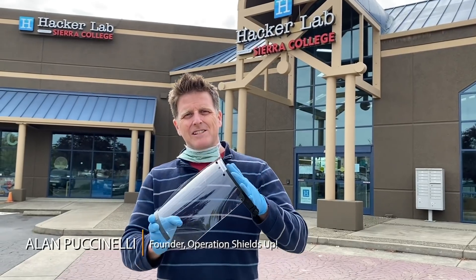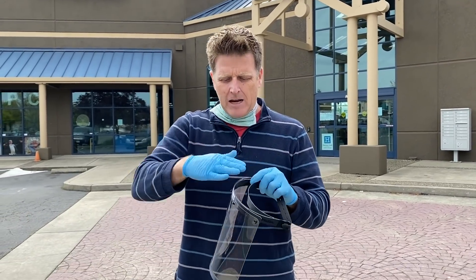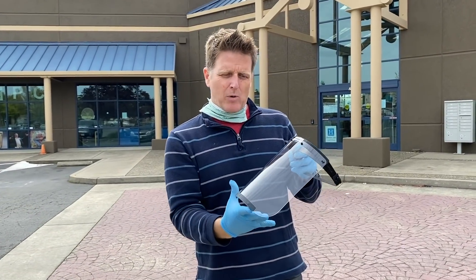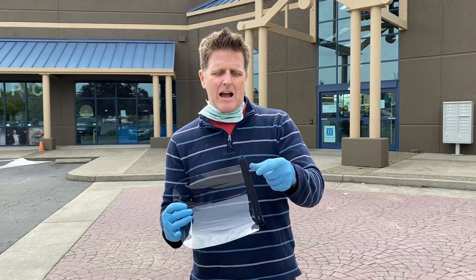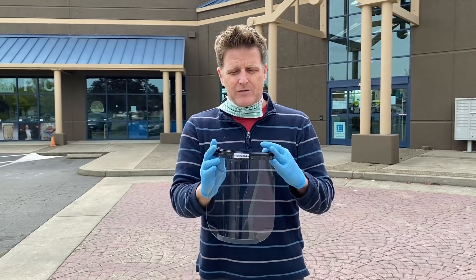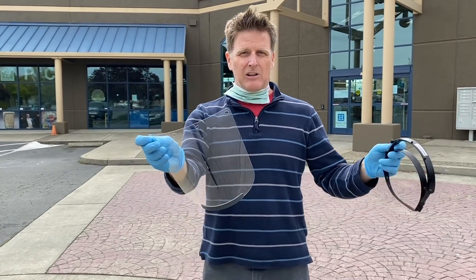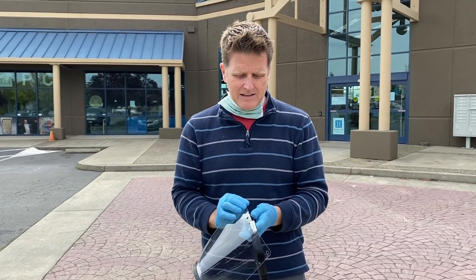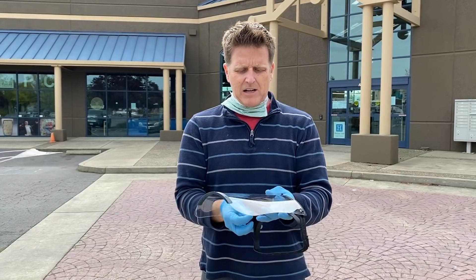This is the face shield we're making — it's a really simple design by Joe Prusa and his team. We've got a frame, a clip at the bottom to help hold the shape of the lens which is laser cut, and then an elastic strap — just buttonhole elastic from your fabric store — so they can be adjustable for different head sizes. The process is really easy, it literally just clips onto the mask like that, takes two seconds.